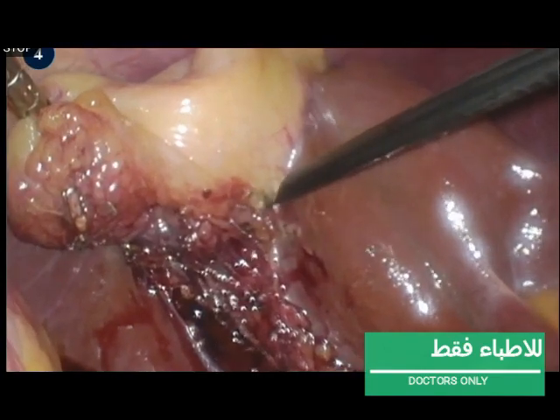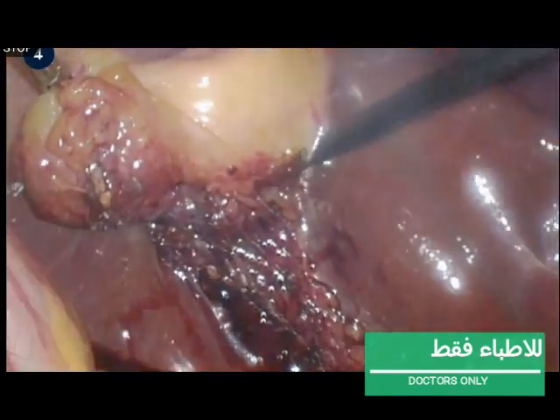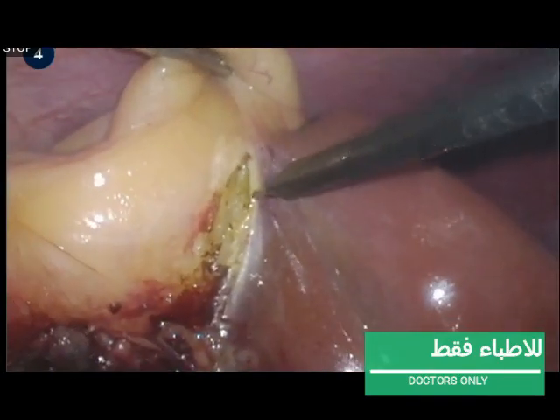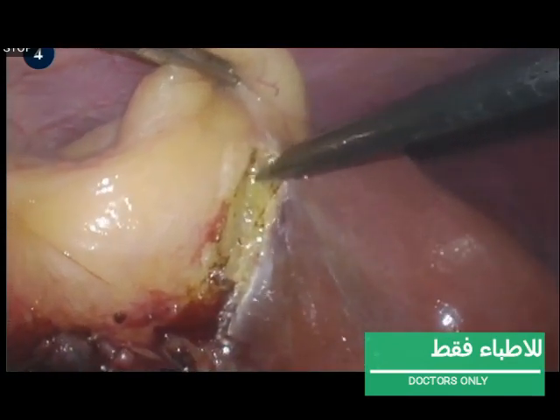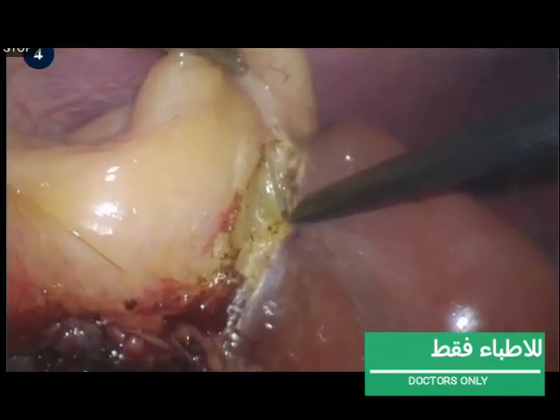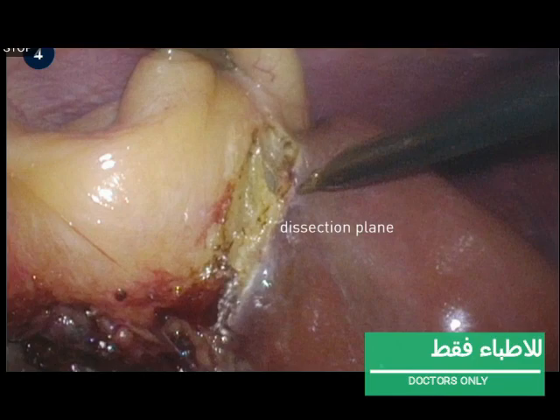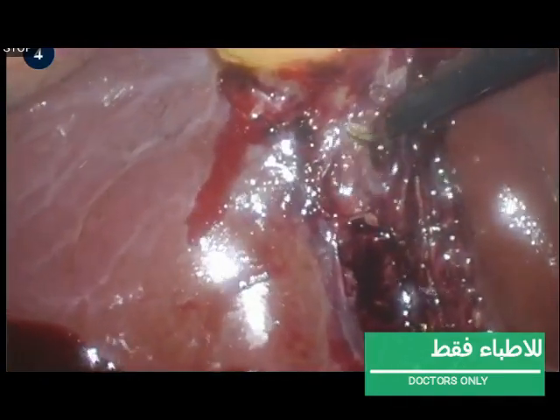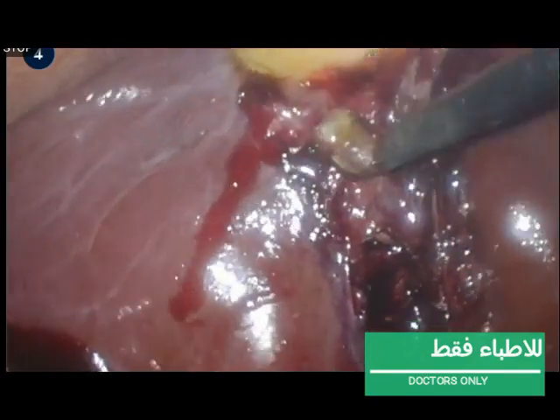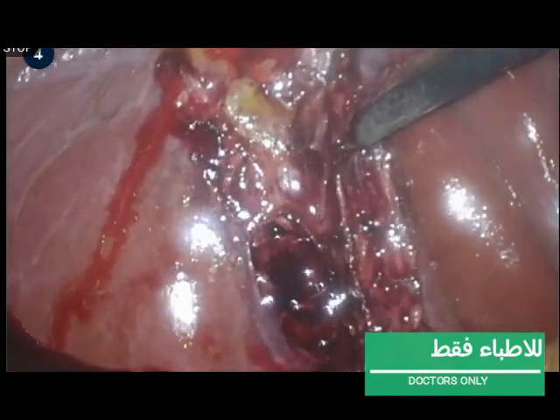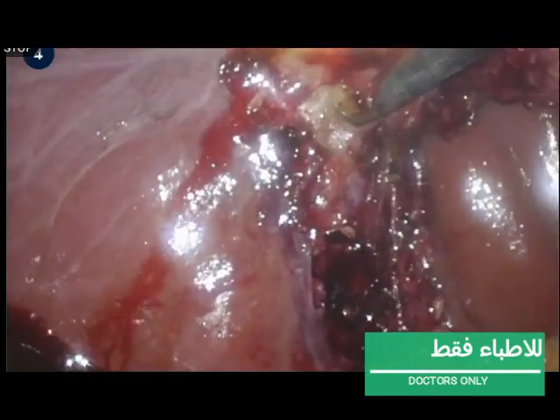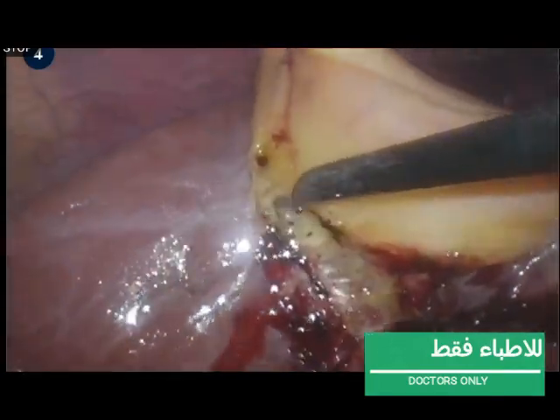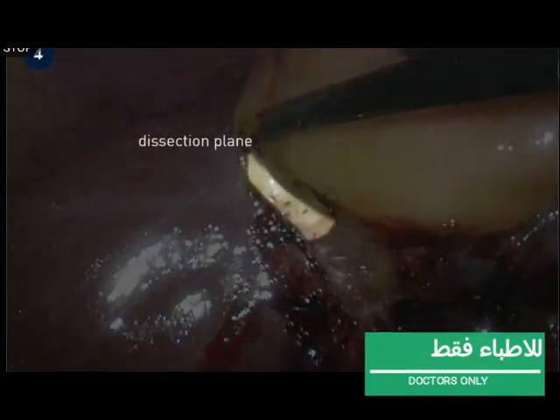The dissection of the gallbladder from the liver is continued to the upper two-thirds of the gallbladder using a laparoscopic hook and electrocautery. The correct plane between the gallbladder and the liver is found and dissected. The gallbladder is dissected at both sides simultaneously. Make sure the gallbladder is retracted superiorly with enough traction so the dissection plane with the white angel hair becomes visible.